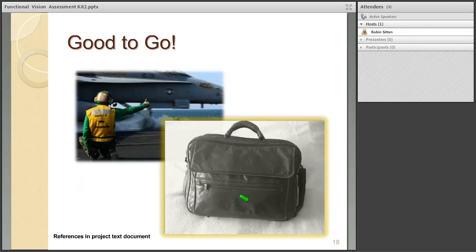Thanks for having a look. A little creativity and not a lot of legwork, and I was able to get the foundation of an FVA kit that I look forward to building over the years.